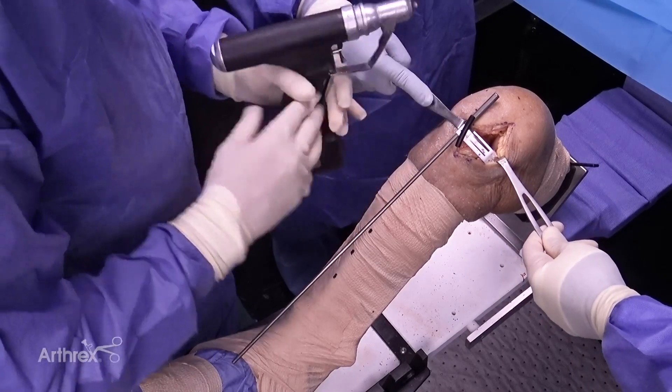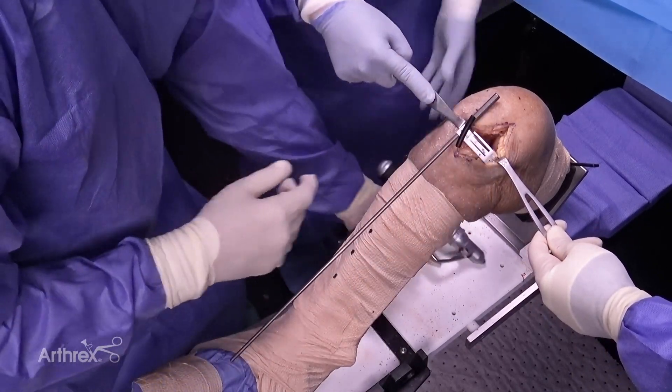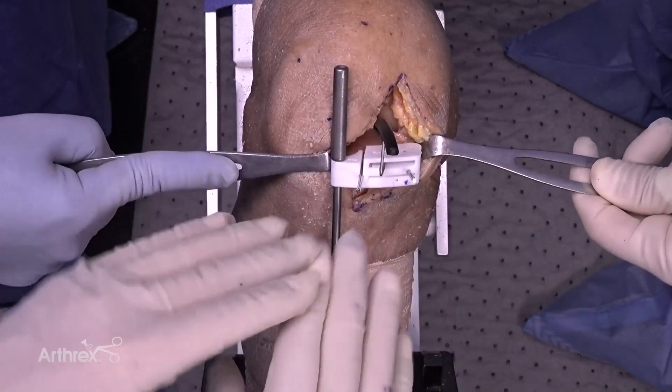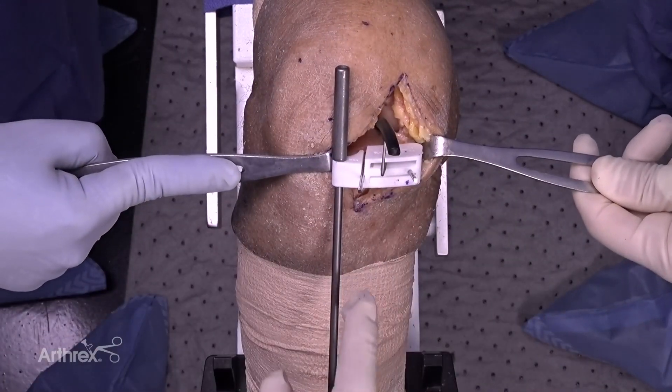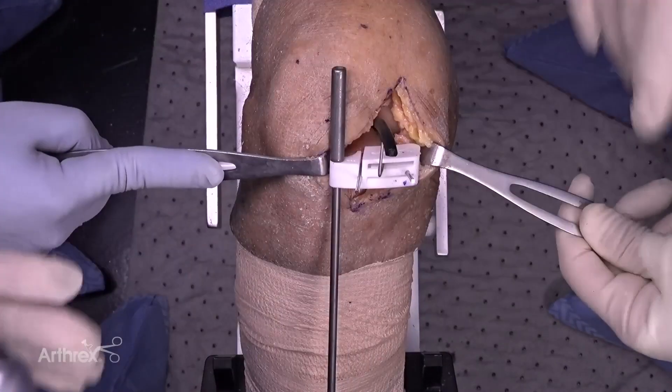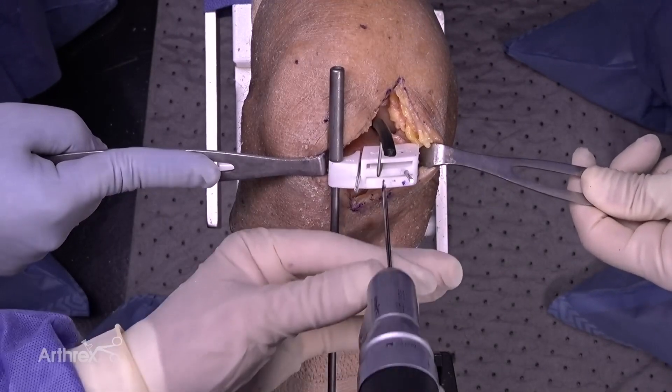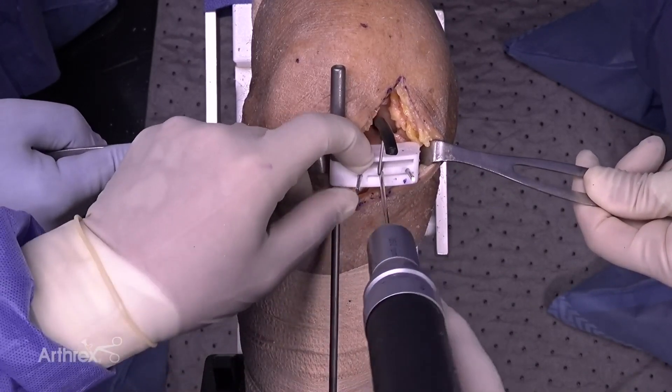In order to get the third pin in, we're going to take our stylus and bend it straight up. What that does is get it out of the way for our last pin and for our saw cut, while at the same time helping maintain fantastic stability of this cutting guide. I'm going to put the last guide pin in.